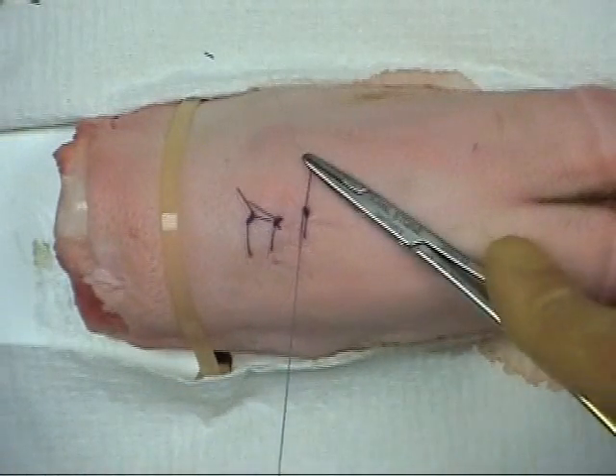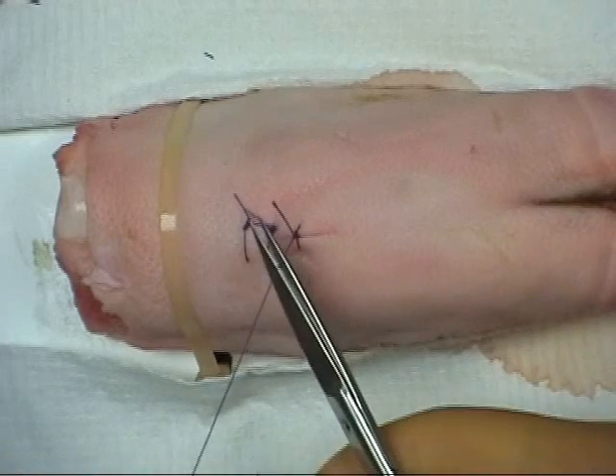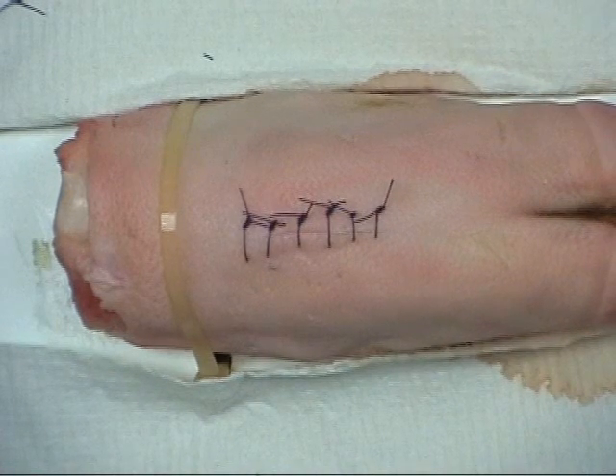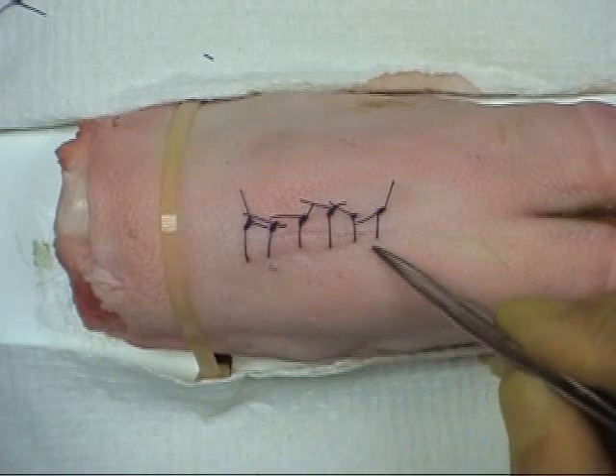Further sutures are placed at equal distances until the wound is closed. Ensure that the knots are sitting at the side of the wound and not directly above the incision site.